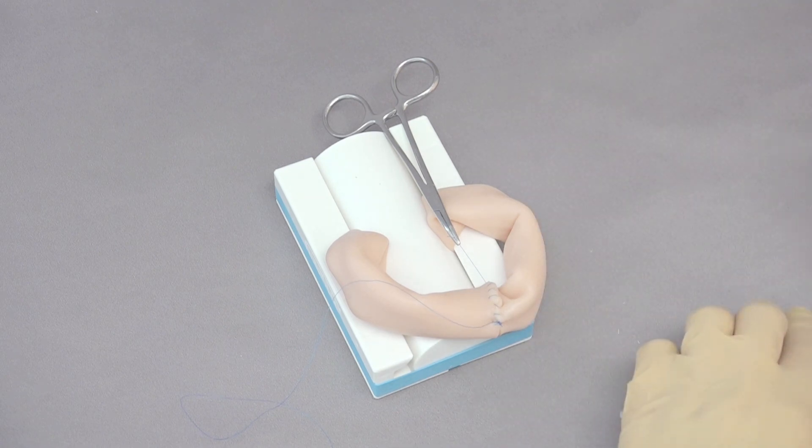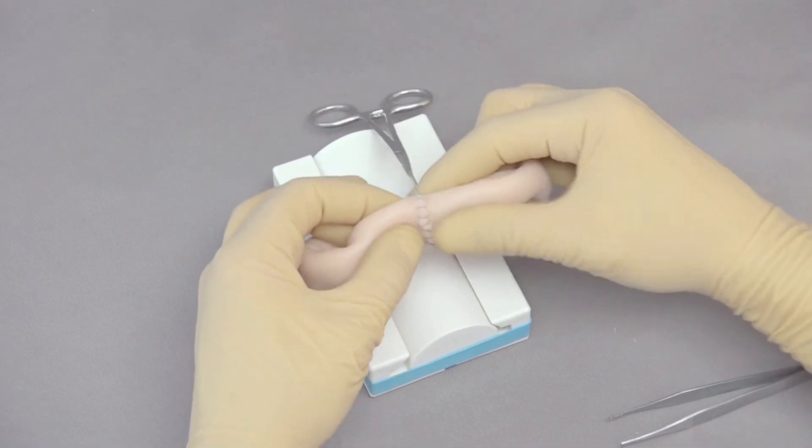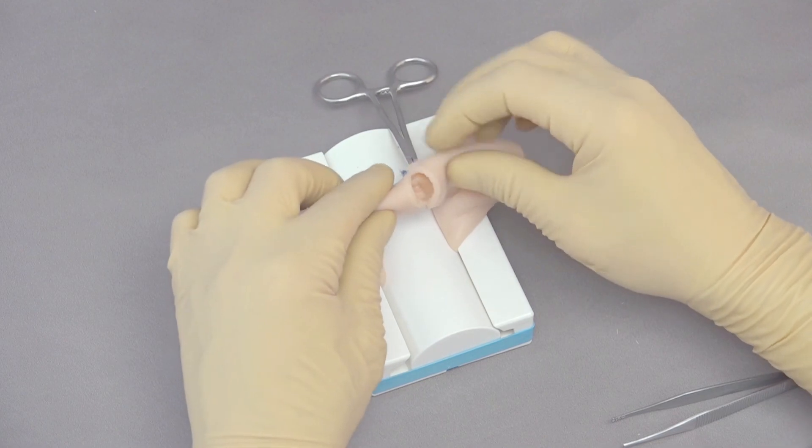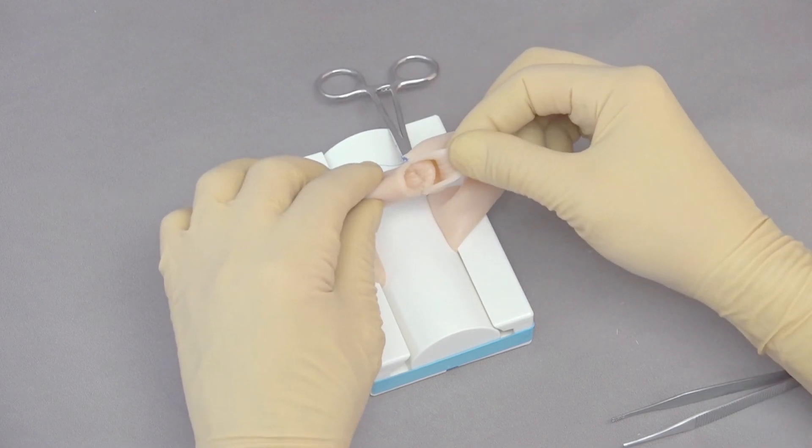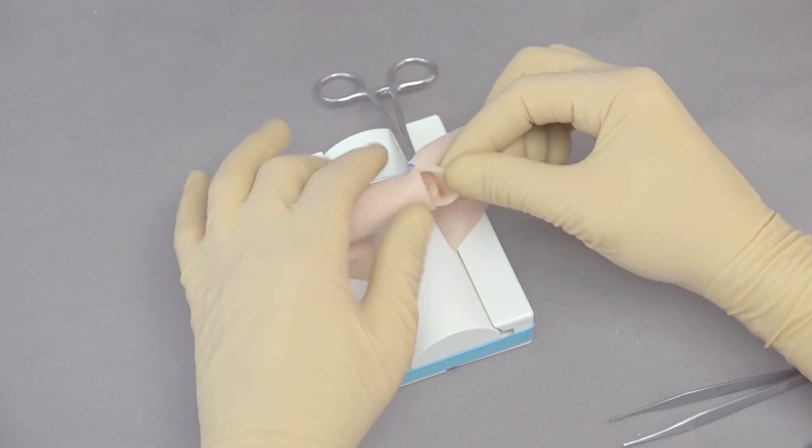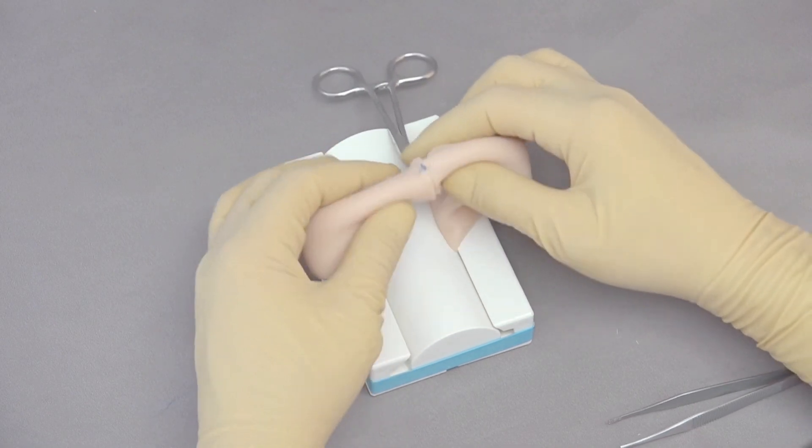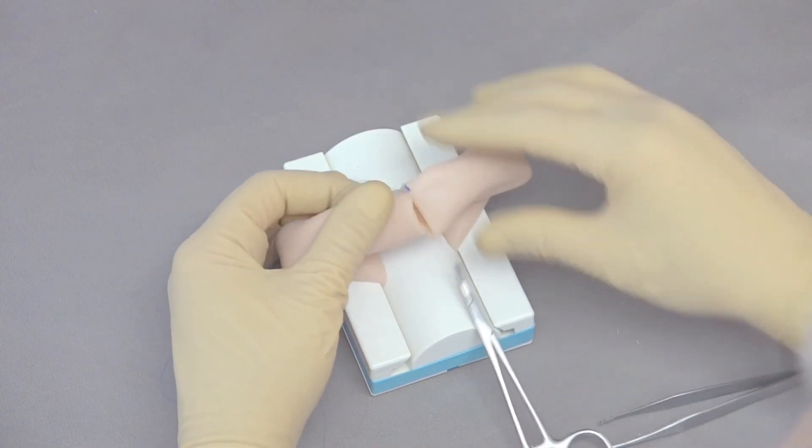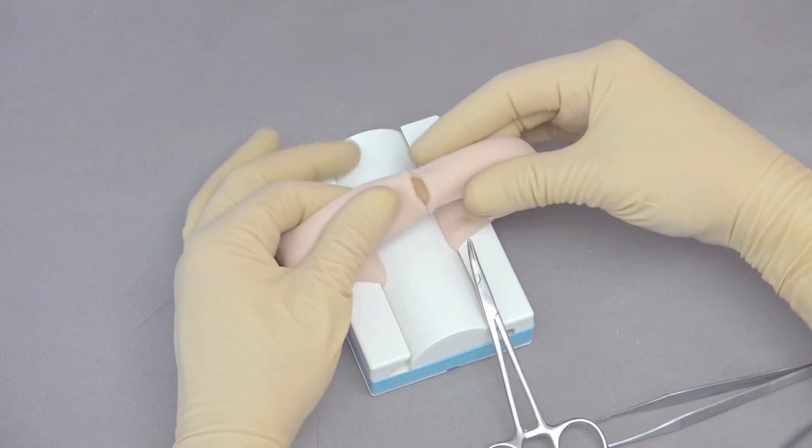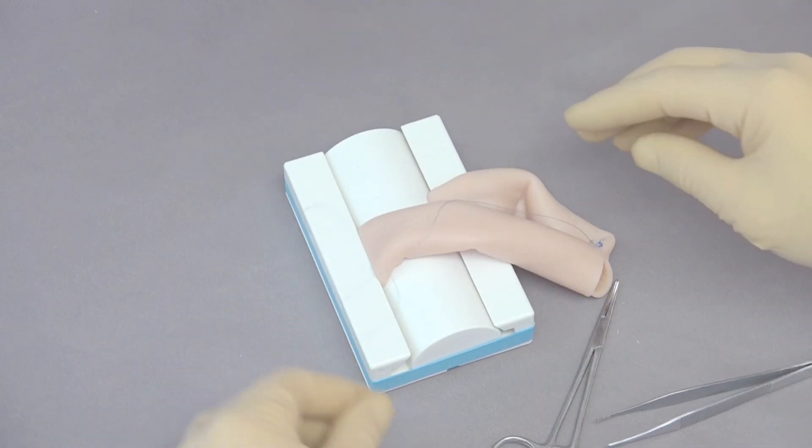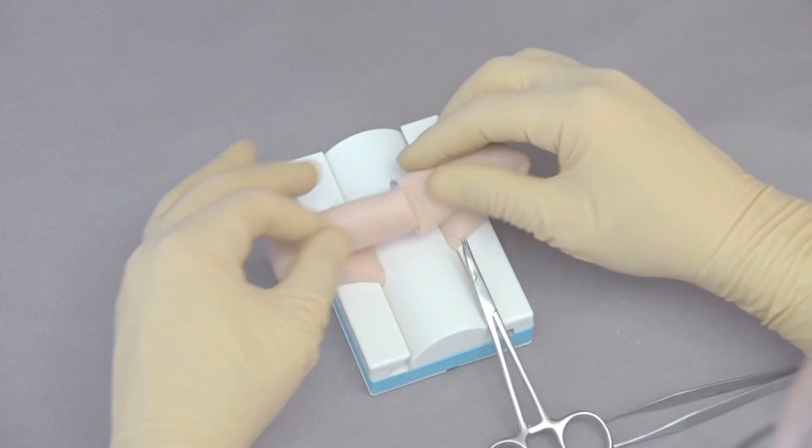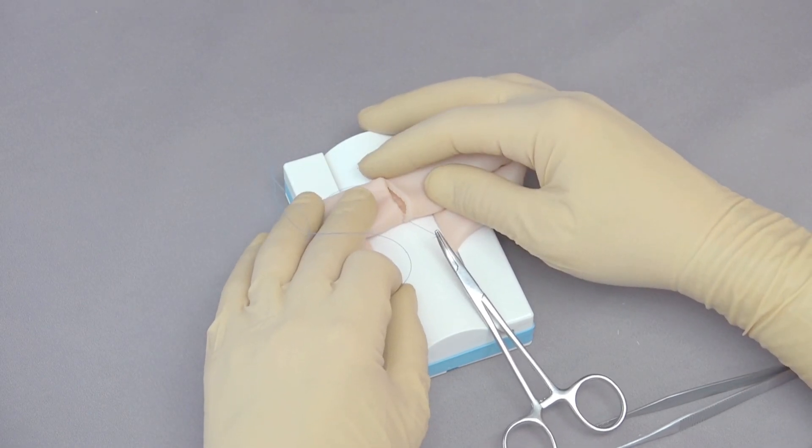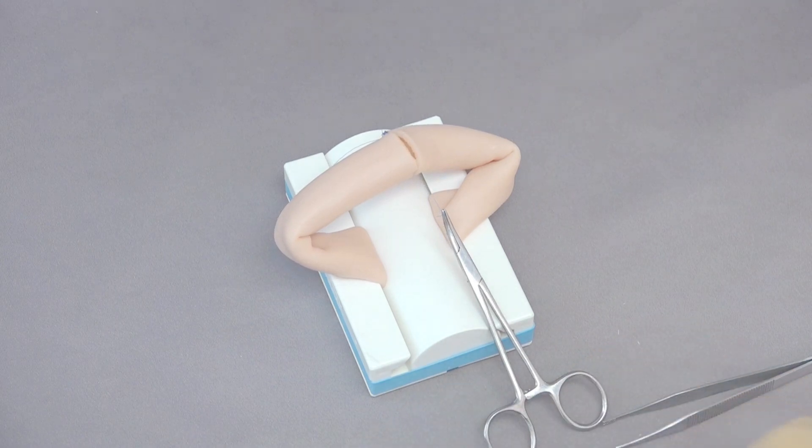Now I can remove that piece of suture and that means I've got half of my intestines sutured here and I have the other half to do. You can appreciate that I have been careful not to go all the way across so I didn't include this side when I was closing this side. Now to close this second side I can just take my hemostats through because I'm trying to suture towards myself because that's the most efficient way to do it. I can push the bowel here and go ahead and close from the anti-mesenteric surface back to the mesenteric surface on this side.